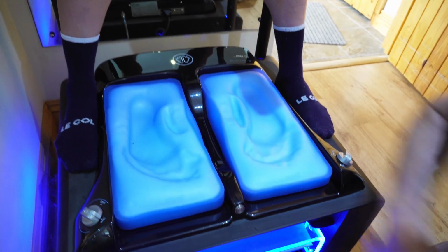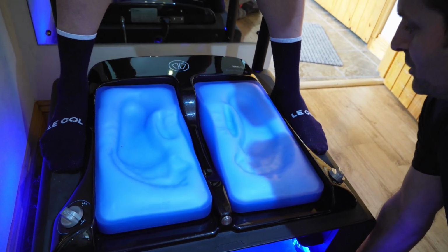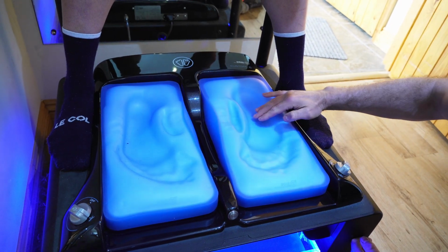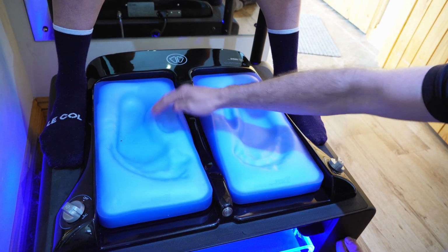A couple of dog hairs there, but there you go. You've got now two different feet there. Notice how the right one is more pronounced than the left one. We've done that deliberately, knowing that when you're standing on that right foot, there's more movement in it.